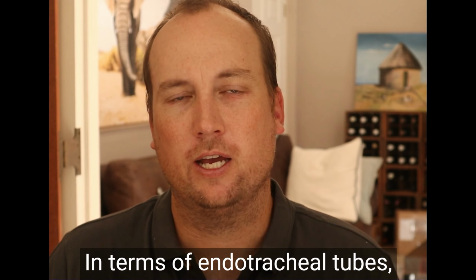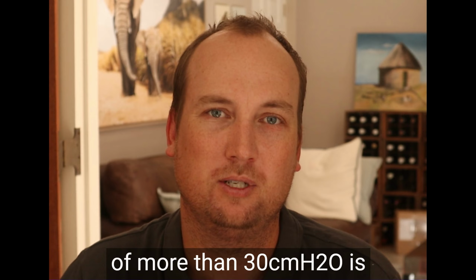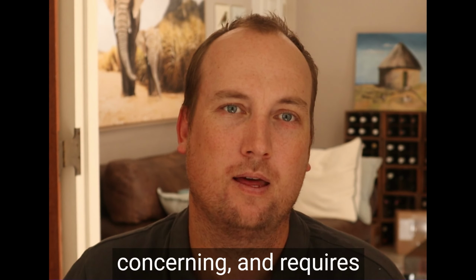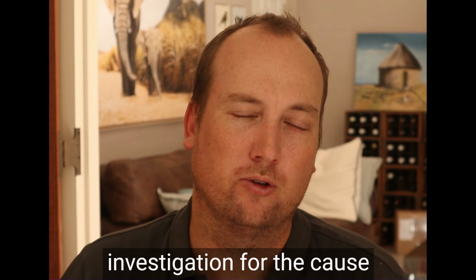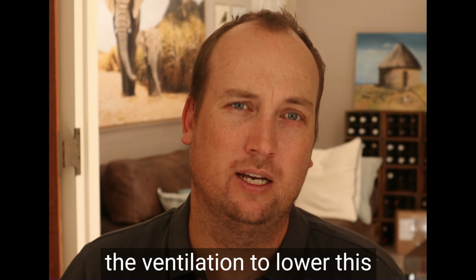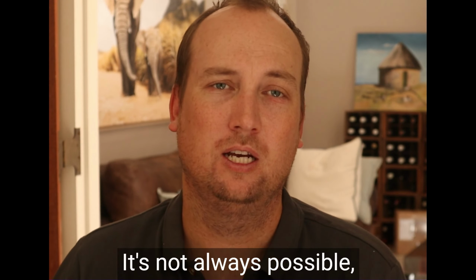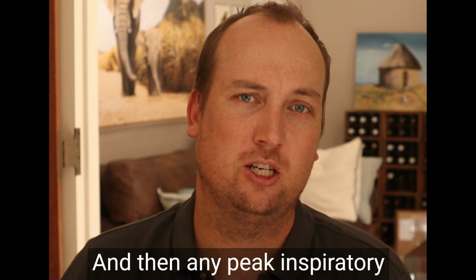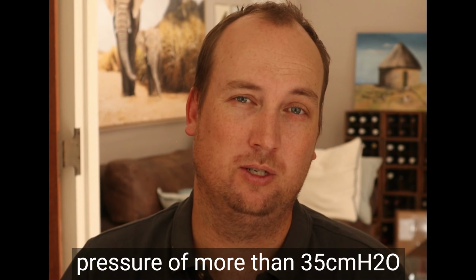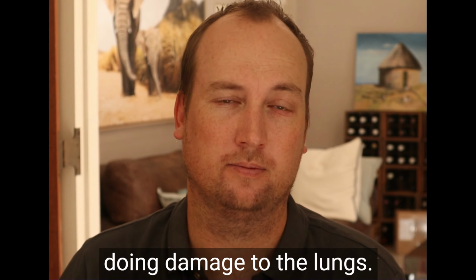In terms of endotracheal tubes, any peak inspiratory pressure of more than 30 centimeters of water is concerning and requires investigation for the cause and an attempt to optimize the ventilation to lower this peak inspiratory pressure. It's not always possible, but one should at least try. And then any peak inspiratory pressure of more than 35 centimeters of water is definitely a concern and is doing damage to the lungs.